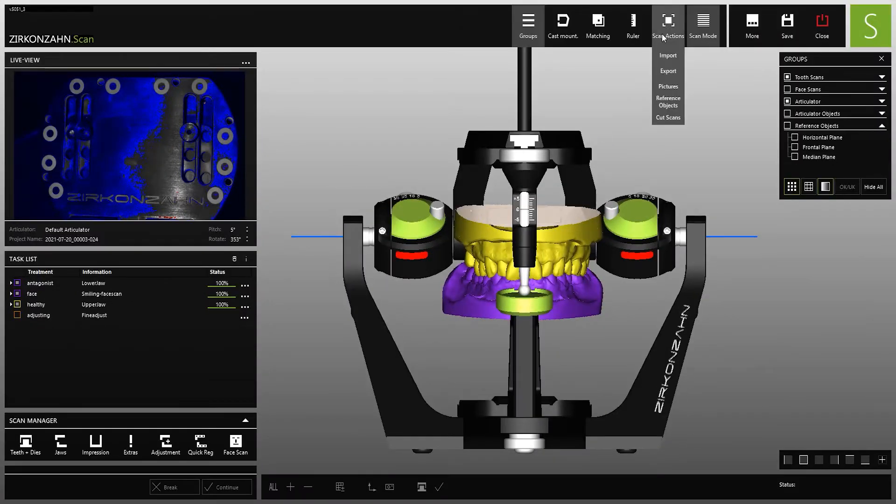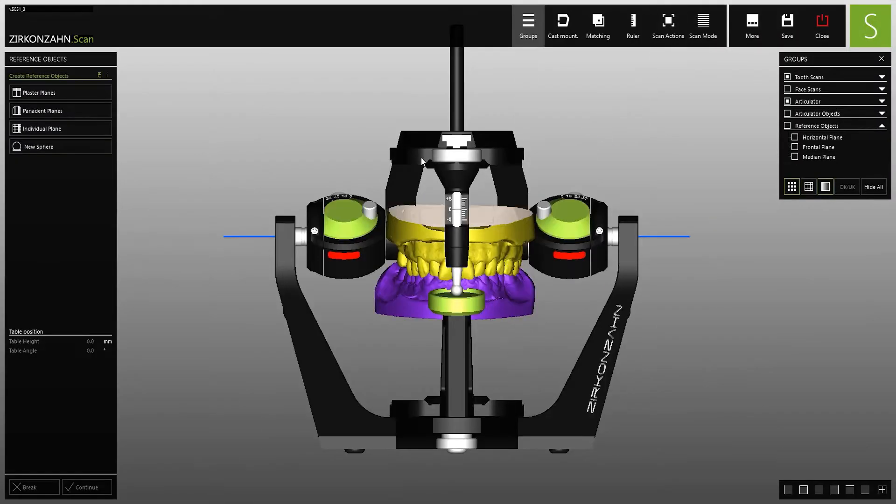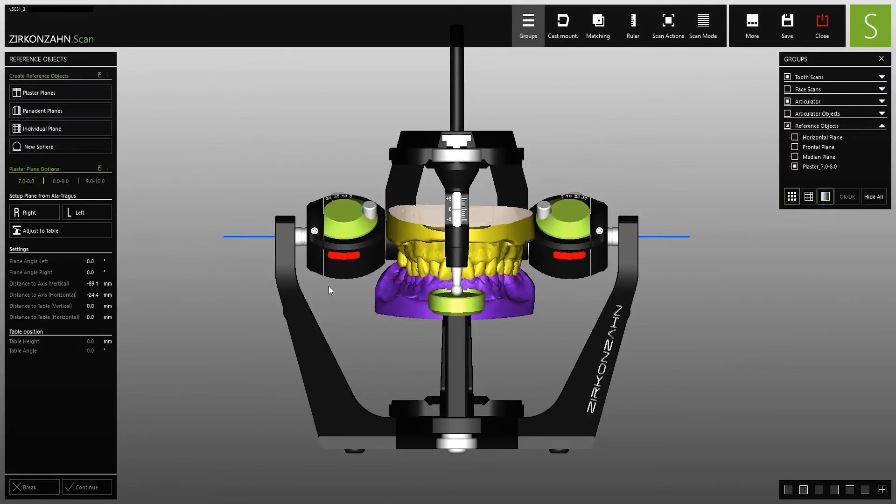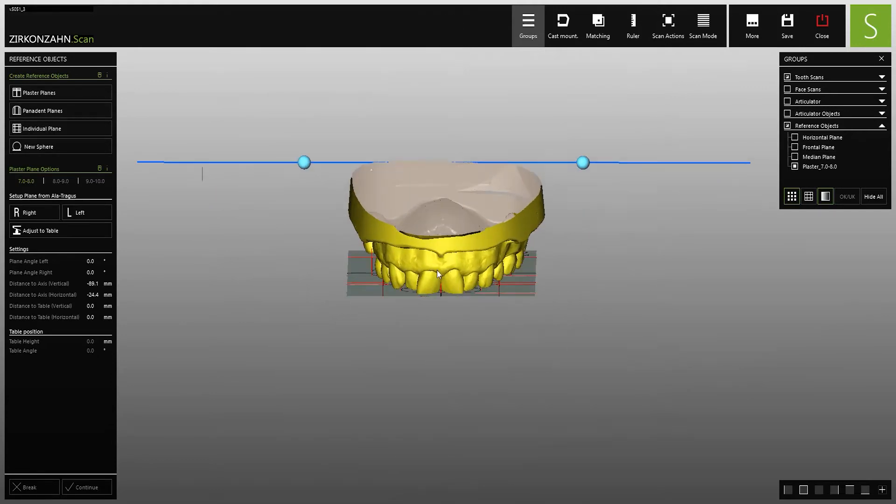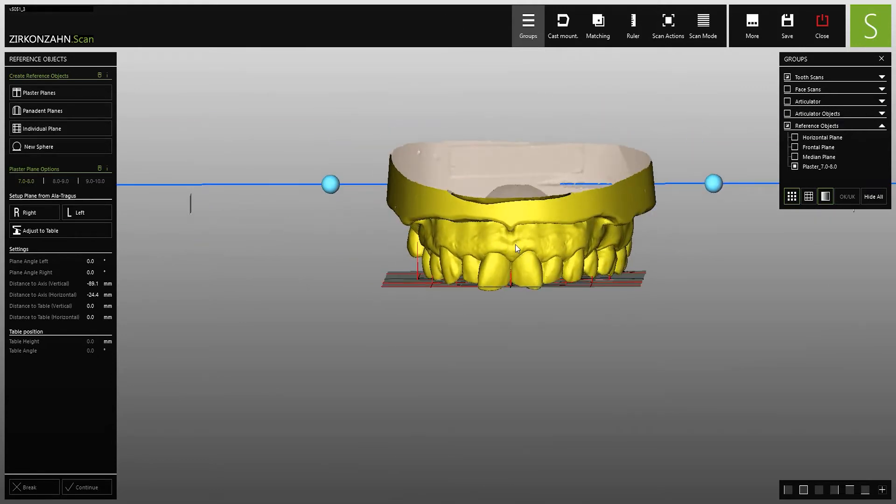The software also permits the loading and aligning of various objects such as the plaster plane, which is used for the teeth setup.